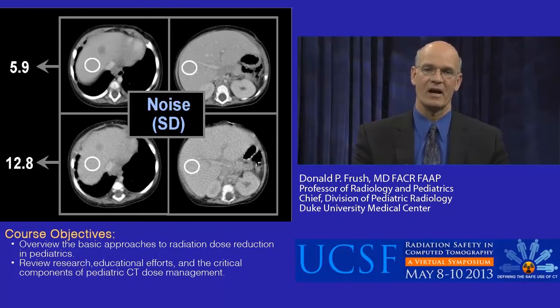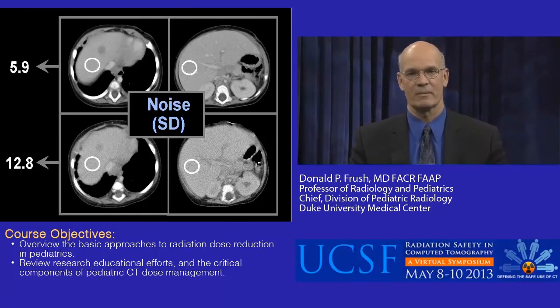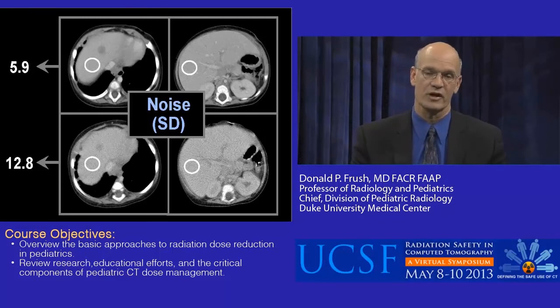The point is, in small children and young children, we tolerate less noise, and so examination should be set up to have a slightly less noisy examination in that age group versus the older age group, that is adolescent populations.